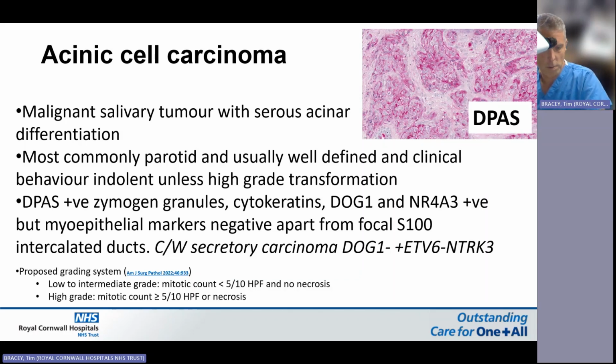I've only seen one of these before. In fact, when secretory carcinoma first appeared in the WHO classification, I looked back through my logbook and found a couple of acinic cell carcinomas that I'd made a few years previously. I pulled them out, and one of them was a secretory carcinoma. They look pretty similar at low power examination.